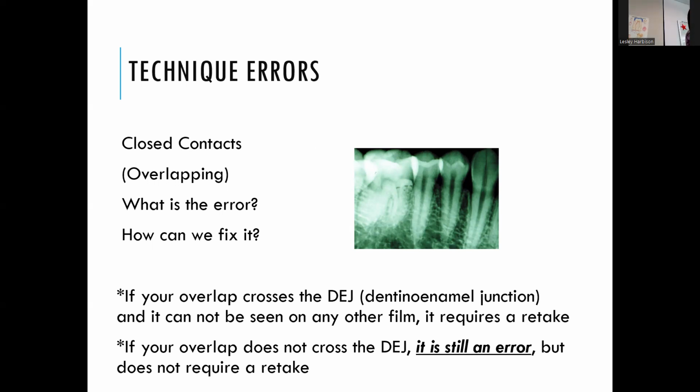That happens so infrequently that it hasn't come up where we've had to address it in clinic. But I would say if it has severely distorted the image, or if it's interfered with that interproximal space where the teeth come in contact, where you're really looking for decay in an area you can't see otherwise, then retake it. But if it's just gone into the enamel, I would probably leave it up to the dentist's discretion. I'd have the dentist take a quick peek at it, because you can always do that. You can flag your instructor and say, I don't know if this needs to be retaken or not, because it's in kind of a unique area and we don't usually have to mess with that.